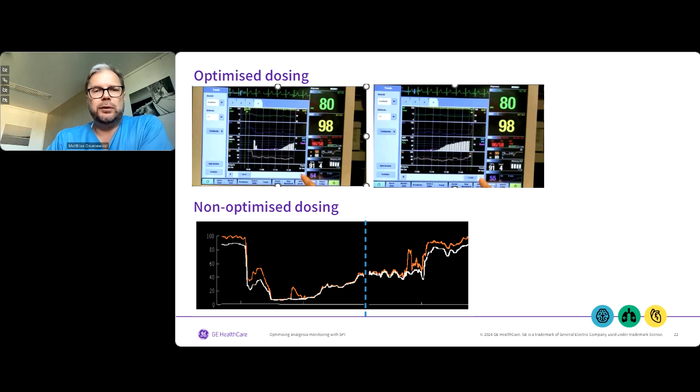I'm very thankful for those slides that have been provided by Anna Maria Bonetto, older monitoring technique. But you see here in this case, we really kept entropy in the target range, and the entropy monitoring shows such a curve.